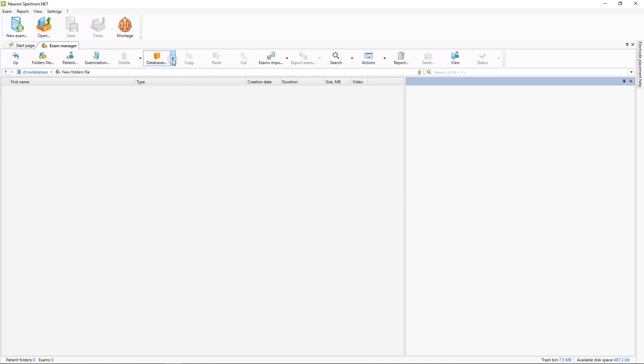You can select the current database. In this software you can use several databases, for example local databases, network databases, and cloud databases.